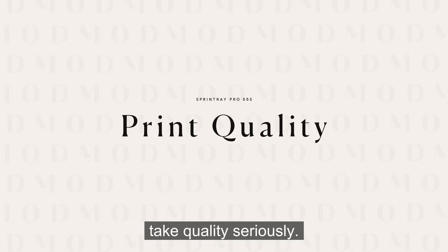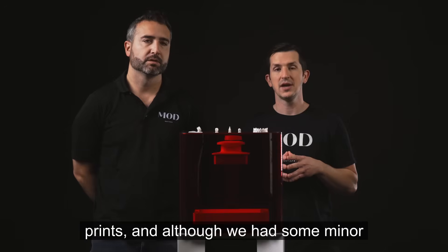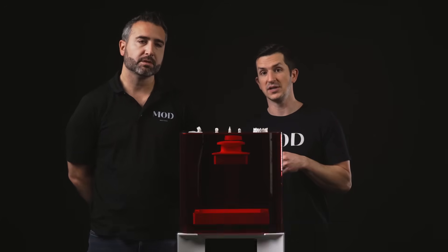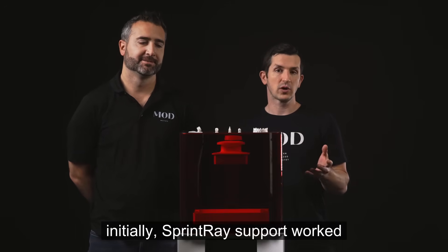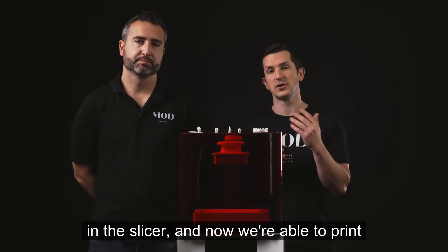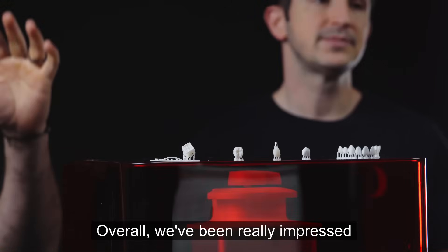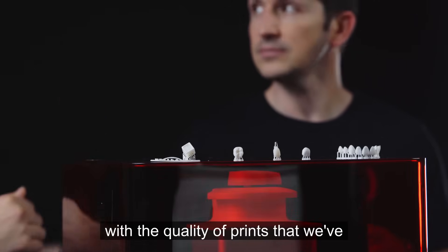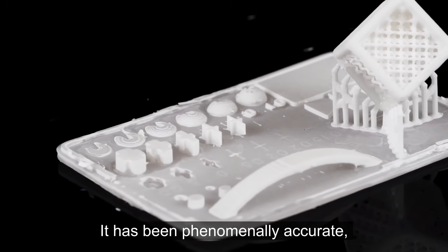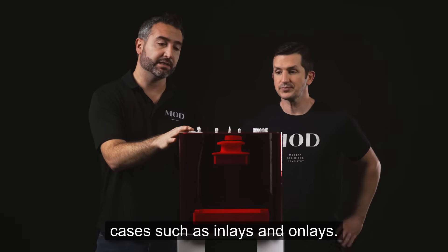It's clear that they take quality seriously. We were blown away with our die and model prints. Although we had some minor issues printing ultra thin veneers initially, Sprintray support worked with us to develop a veneer mode in the slicer, and now we're able to print ultra thin veneers very predictably on this printer. Overall, we've been really impressed with the quality of prints, which has been phenomenally accurate for both models and patient care cases such as inlays and onlays.